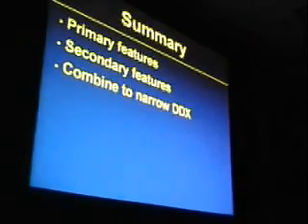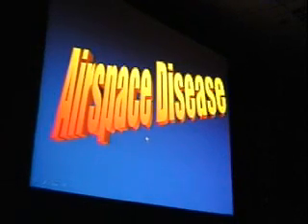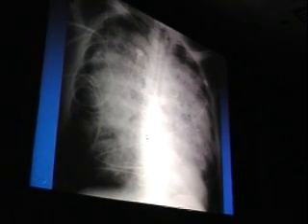Okay, we're going to stop right there and more or less immediately, to stay on time, move into a discussion of airspace disease, everybody's favorite topic. Now, the problem with airspace disease is not necessarily in the diagnosis of it.